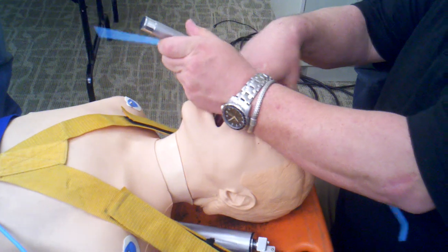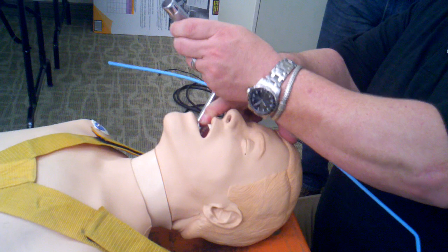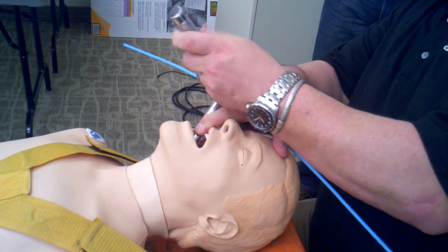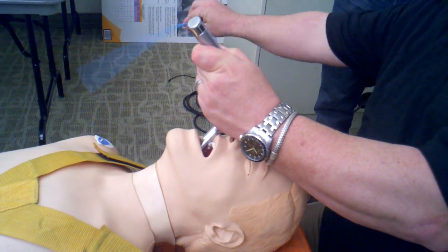Sweep the blade over onto the second or third molar on the right. Anchor it in place with the index finger of the right hand, then perform a jaw thrust using the tip of the blade. Looking down the barrel of the Miller until we get a partial glottic view.